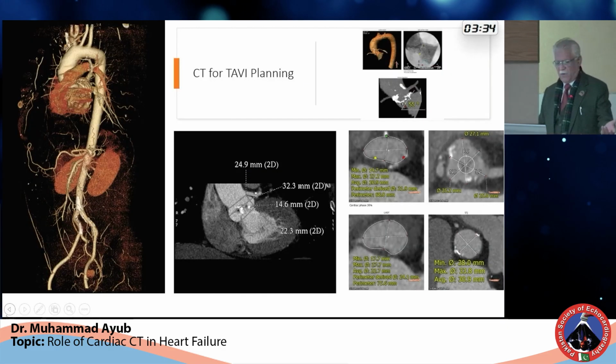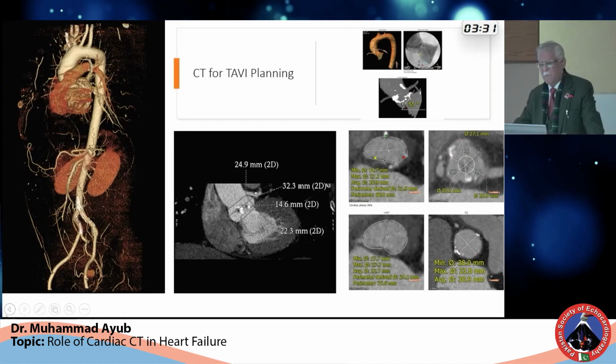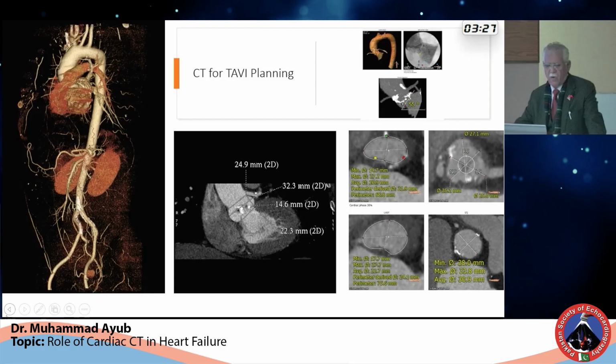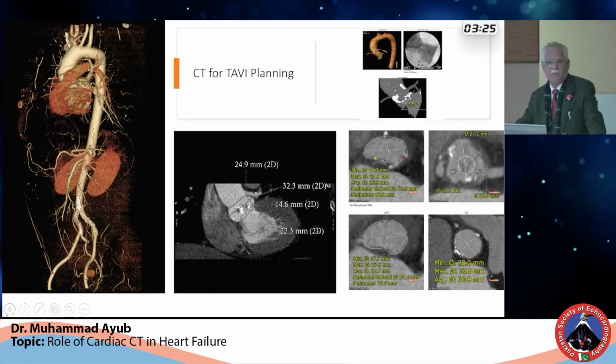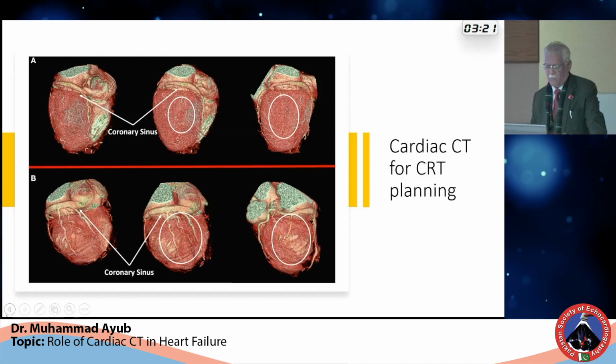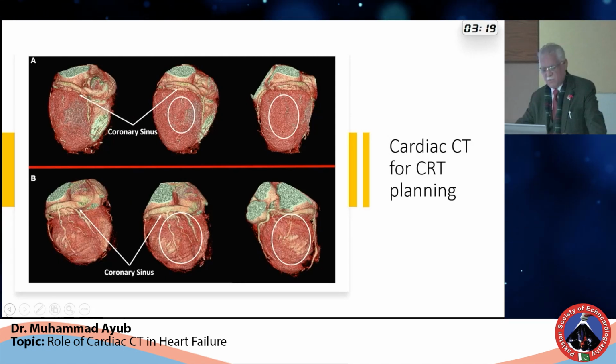Similarly, for TAVI planning, you give all the measurements of the aortic root, coronary ostial heights, and also you define the access for the TAVI procedure with CT. So it's a mandatory tool before TAVI procedure.